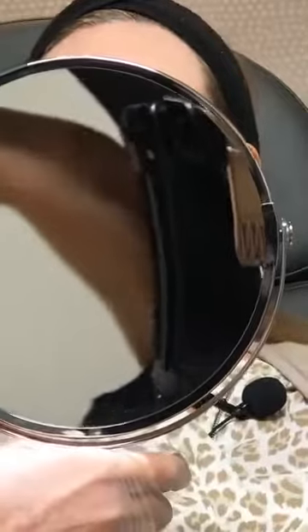A little bit more in the center here. And again, aspirating each time just to make sure we're not in any vessels. Injecting very slowly, which also helps with pain. So there you can see a little bit of a difference. Now, I think she could go a little bit bigger, but let's see what she thinks. And obviously, we're not done.